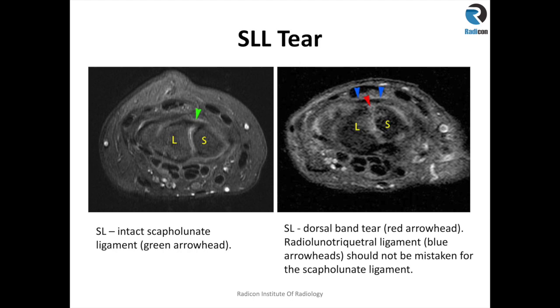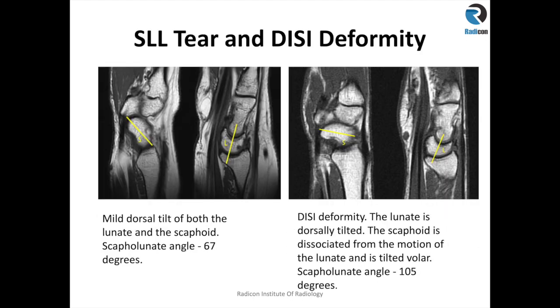Be careful — there is another extrinsic ligament which runs dorsal to, or superficial to, the scapholunate ligament, called the radial lunotriquetral ligament, as demonstrated by the blue arrowheads. This is an extrinsic ligament of the wrist. Mild dorsal tilt is accepted; it may be that the patient had the wrist scanned in ulnar deviation, which can give false positive results.